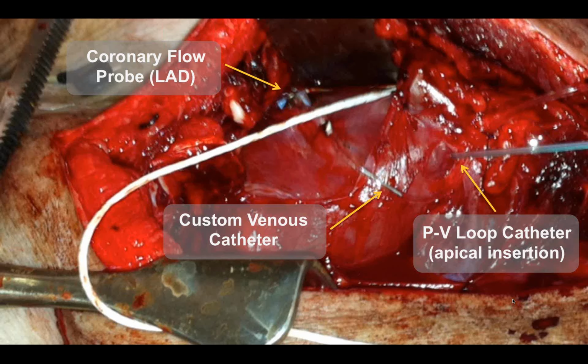Okay, here I want to share a little bit more about our methodology, and here's one of our terminal procedures where we've done a sternotomy, and we've placed our coronary flow probe here on the left anterior descending coronary artery, and you can see it tracking off here in the white. We also have a custom-made venous catheter that we can sample venous blood from the great cardiac vein. And then also you can see our PV loop catheter, and we use an apical insertion in our particular prep because we feel like it really helps us optimize placement of the catheter and gets us the best signal for our pressure volume loops.